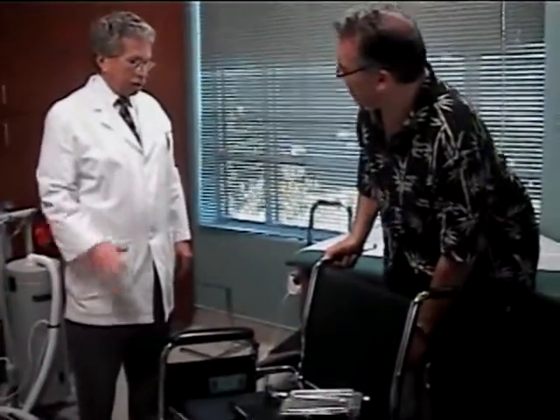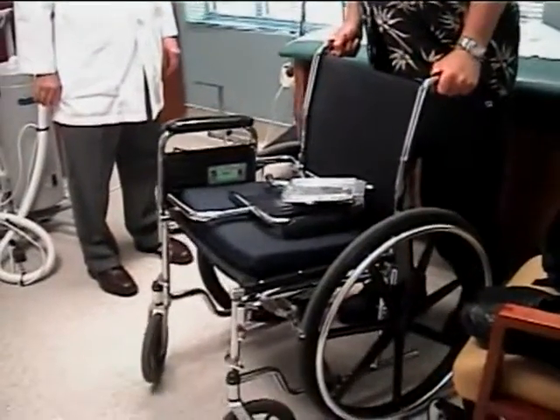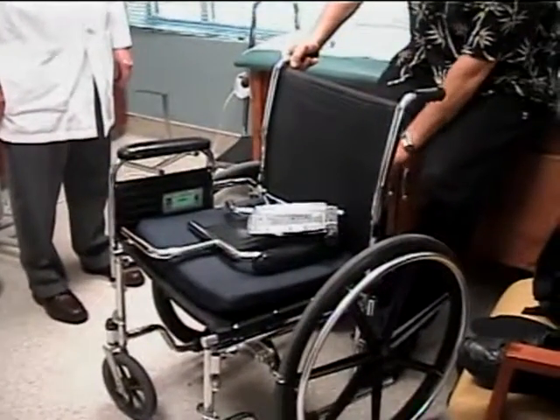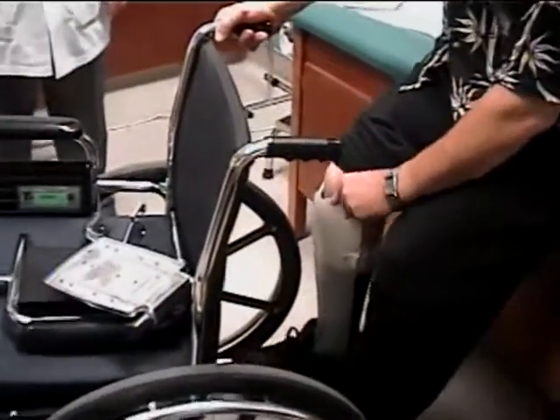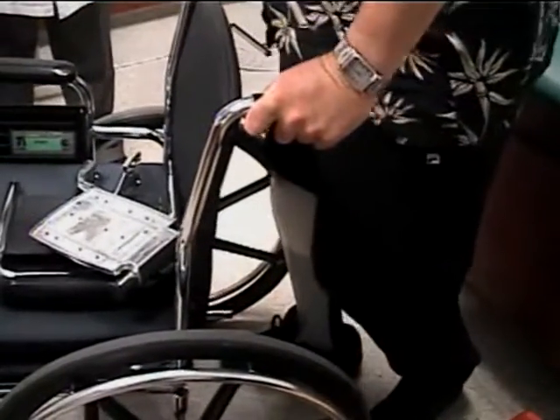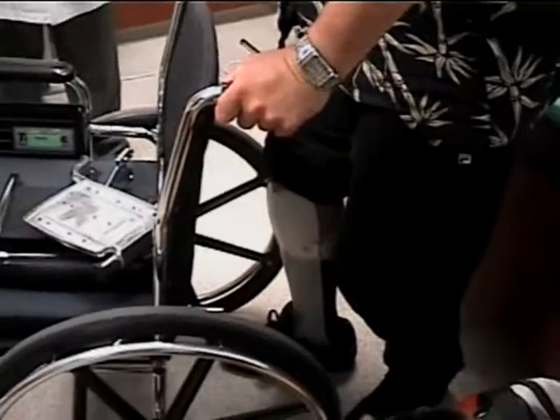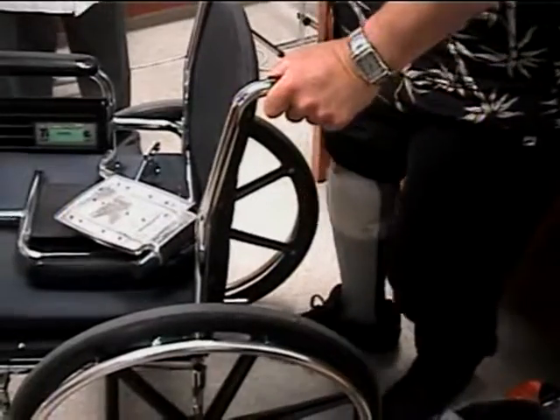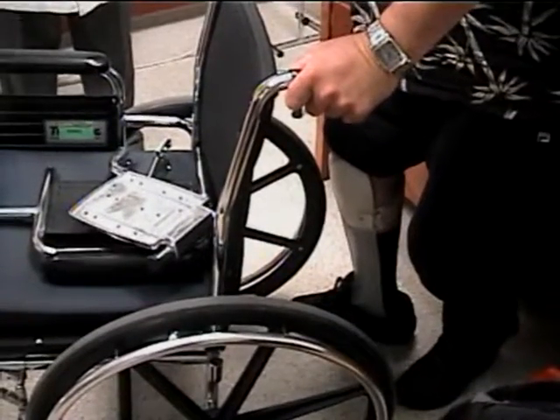It's hitting my knee right here. Well, it's meant to push your knee back. I can feel it - it takes a little getting used to. You can always go back and have them flare that a little bit. Do you have any cushion I could put on that? A little pad? There's some on there now but it doesn't go up far enough. You really have to use it for a little bit and then go back there. Randy made that, right? Is it Randy over at Scope? Yeah. All you've got to do is go back there - he's right around the corner here and he can trim that back. You don't need an appointment for that - just call and make sure he's there.